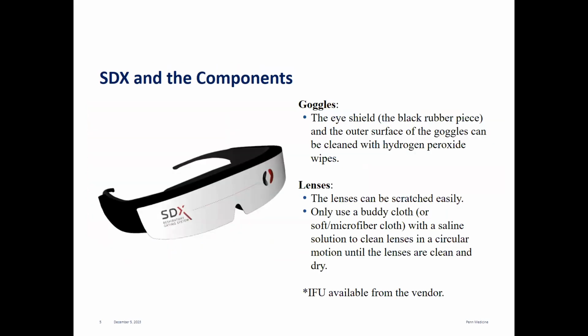So this is the SDX goggles. This slide shows what the glasses look like. It is a sleek design with a black rubber piece on it that helps shield the eyes from other distractions that might occur in the room.